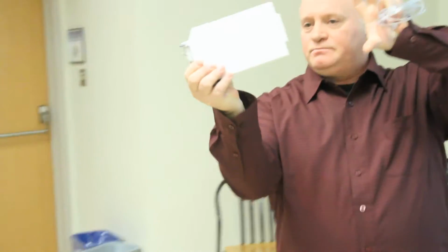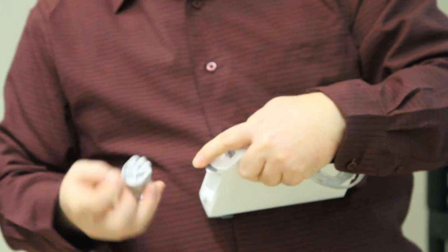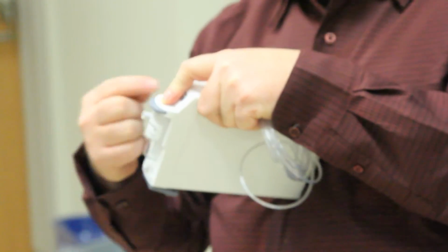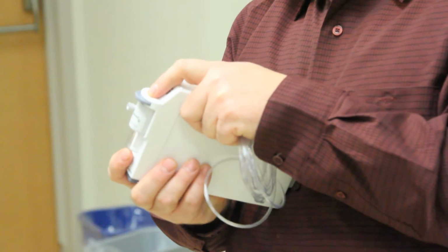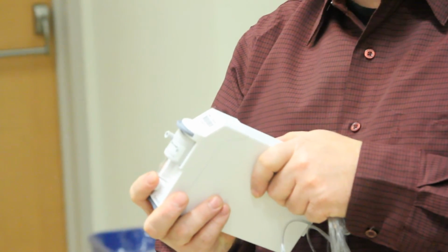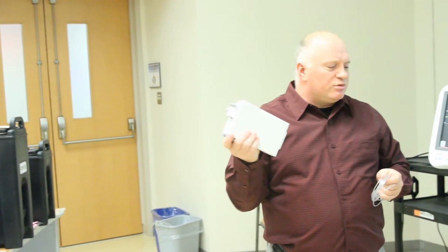is a little click in the monitor, it snaps in, and there's a little water trap that snaps into that module. The water trap's important, as Brendan mentioned, because it will suck up secretions and some bit of moisture with it. Mostly for your patient population, we're not going to get lots and lots of goop put in there. But we don't like this in the ICU, because there's lots and lots of secretions and pneumonia in the ICU, and you get lots of material building up in that circuit, and it occludes us off all the time. So this isn't a great one for the ICU, but a great one for emerge. Mainstream is probably a little bit better for our ICU.